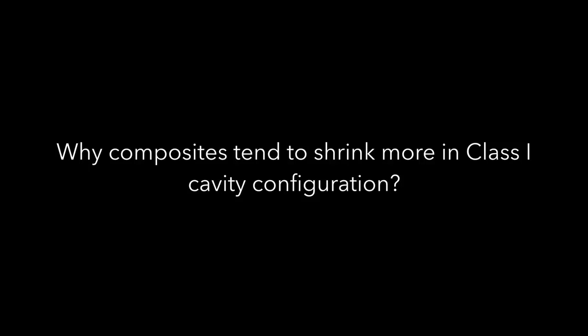And to avoid the class 1 problem, we can use pre-polymerized resins, we can use silorane based composites, and we can also use the snowplow technique, like Dr. Kashif explained, where you use the flowable in the base and then pack the packable in that, so that it can go into the voids.